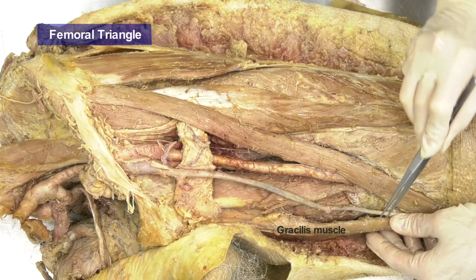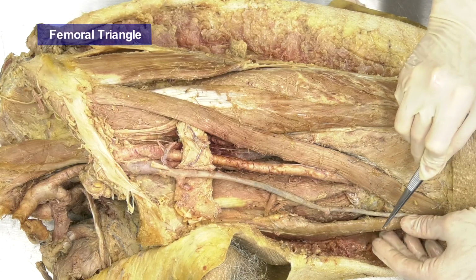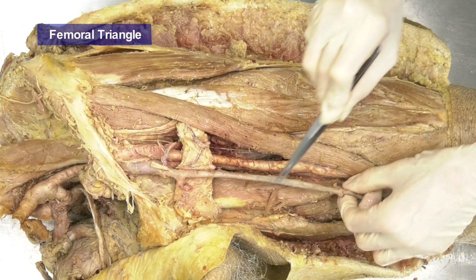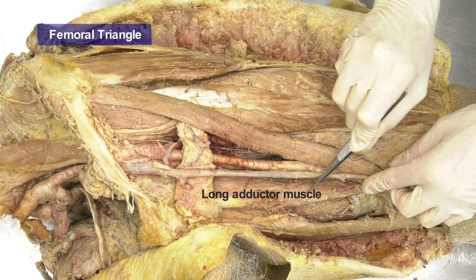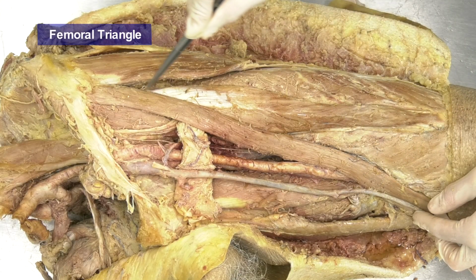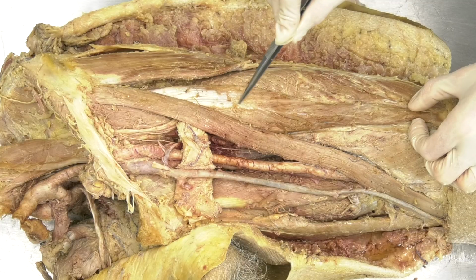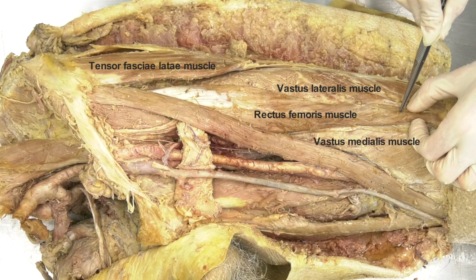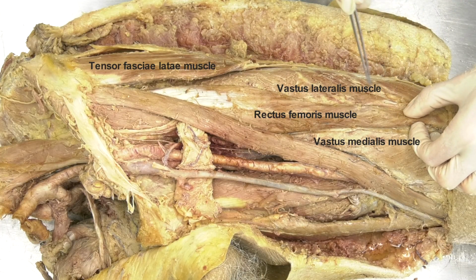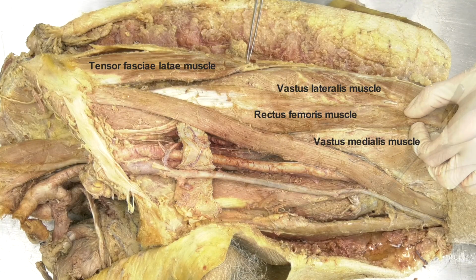Medially, the gracilis muscle and the long adductor muscle. Moving laterally, we can describe sartorius muscle and outside the triangle, the rectus femoris muscle, the vastus lateralis muscle, and the tensor fasciae latae muscle.